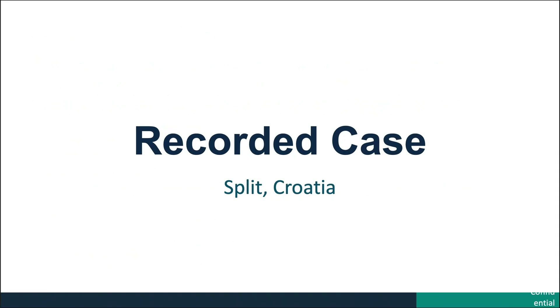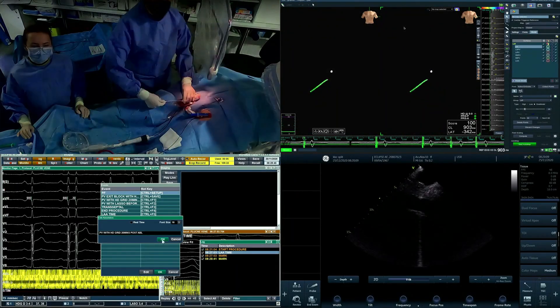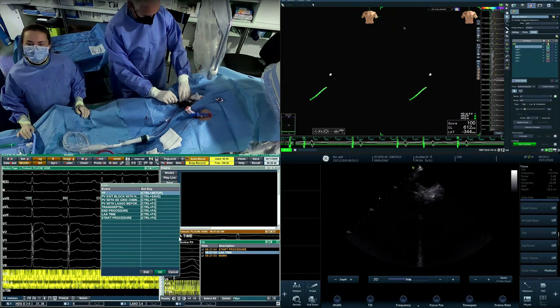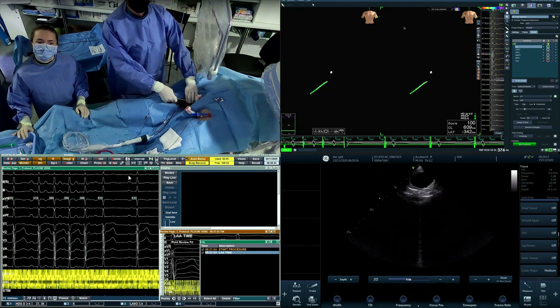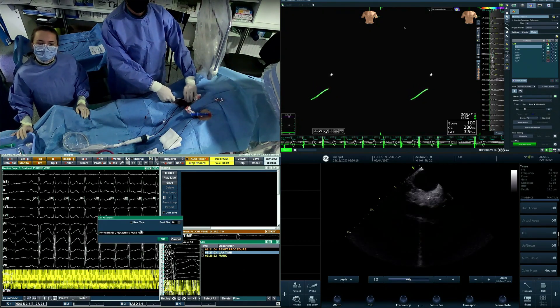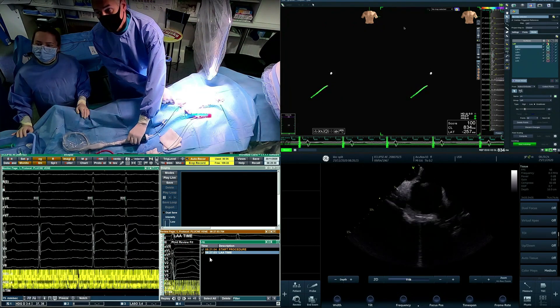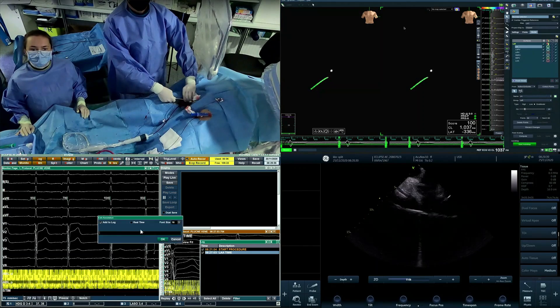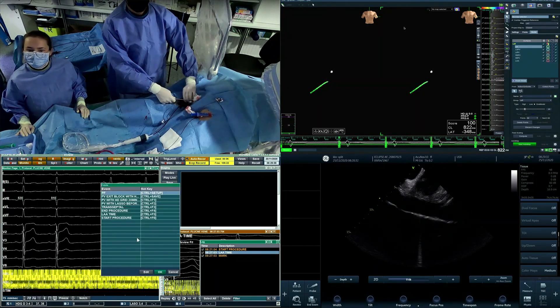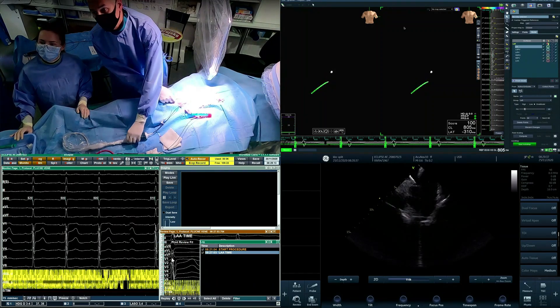This is a video of the Galaxy PVI case performed in an EP lab in Split in late November 2020. You will have four panels — in the left upper corner you're going to see catheter manipulation. It's a usual setup for a Navix-assisted PVI case. From the left groin we put up a standard decapolar catheter as a reference catheter for the mapping system, and from the right groin we go with an intracardiac echo catheter and a transseptal sheath.